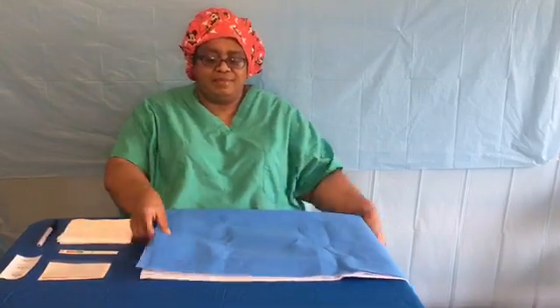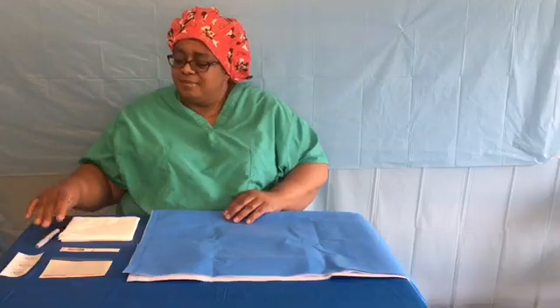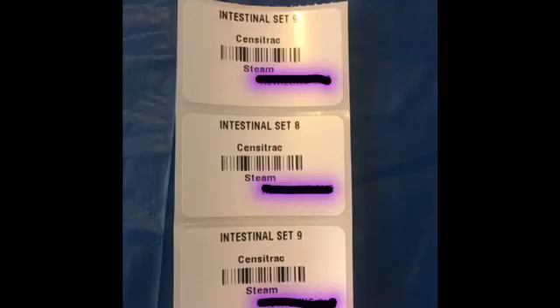I have a 30 inch recyclable wrapping and you should always check for holes before you wrap anything. Some of the items that I will be using today is a size 30 inch wrap, absorbent tray liner, sharpie, integrator, count me out sheet, labels, and tape.